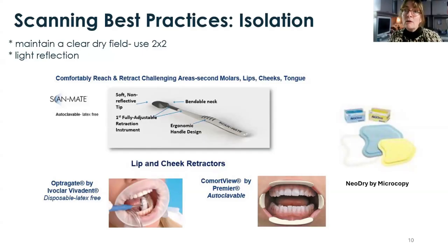So a patient most likely with a complete complement of dentition. And for me, it's all about keeping the area dry. I'm not a super big fan of just an air water syringe, right? Blow the saliva away. By the time I pick up my scanner, the saliva has swooshed back. So there's a few different items that help, especially new users, to create a good field of the oral cavity.